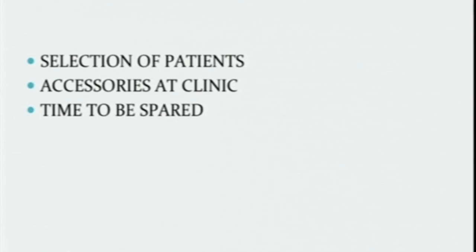Along with that, a keratometer is better equipped. And then if you want a selective range of patients for higher contact lenses like ortho-K or other lenses, we need to have a topographer. And more important is the time to be spared, because you need more time to spend with these patients to motivate them for fitting and then for post-fitting methods.